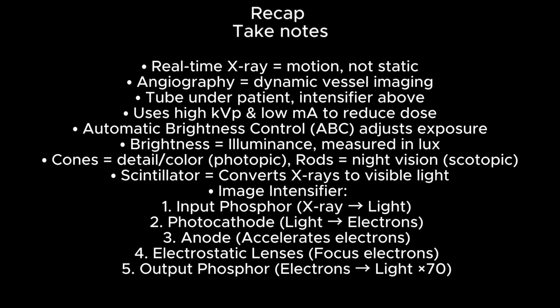Alright, so let's run it back one more time. I know this is a short video, but you can repeat it as much as you want. So, fluoro is all about dynamic imaging, real-time X-ray motion. It's like watching a live video inside the body. Angiography, that's the application where we watch contrast move through vessels. If it's the brain or spinal cord, that's neuroradiology. If it's the vessels in the rest of the body, that's vascular radiology.